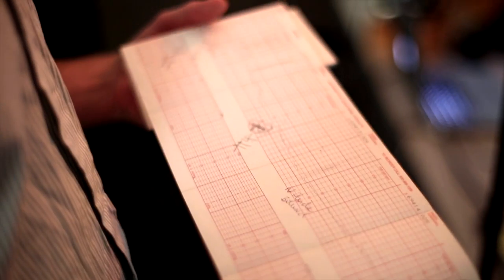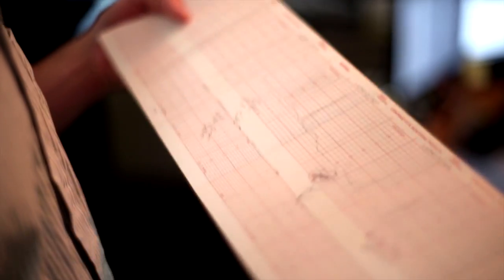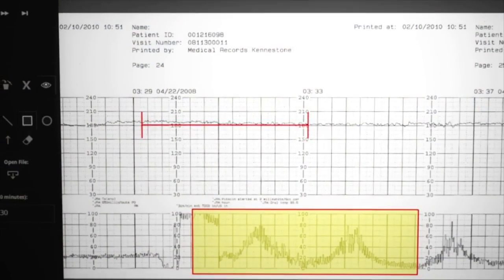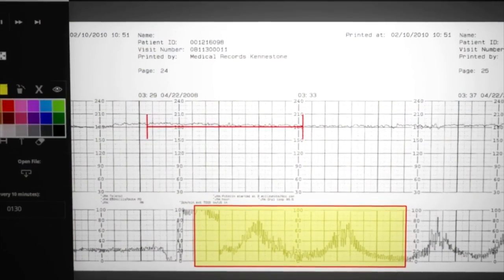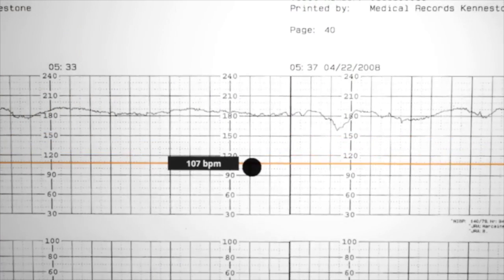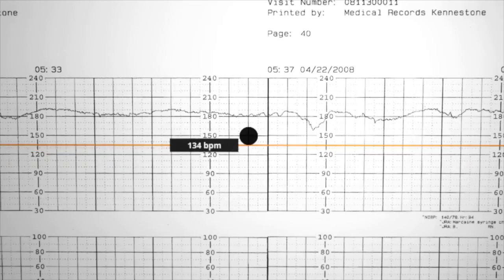Fetal monitor strips typically come on a large paper roll or a large stack. What we do is take that roll or stack of papers, piece it back together into one continuous strip, and the digit strip software allows us to present the fetal monitor strip in a continuous format.